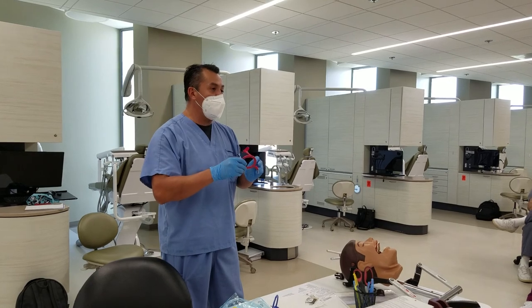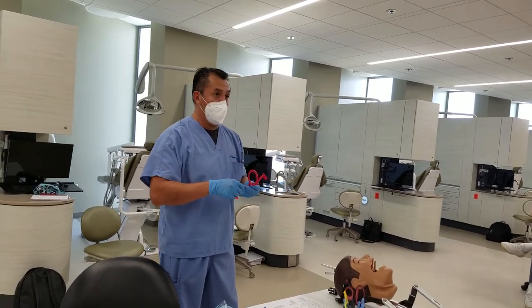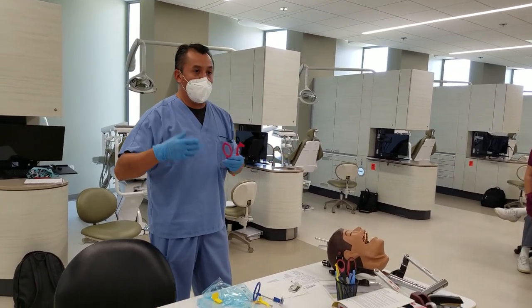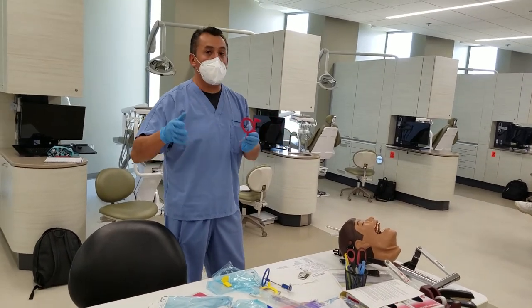Generally speaking, bi-wings are mainly used to diagnose cavities between the teeth, especially for children. Depending upon what the doctor is looking for, we get bi-wings. For a full mouth series, you're going to take PAs and bi-wings, because you have to be trained on both.